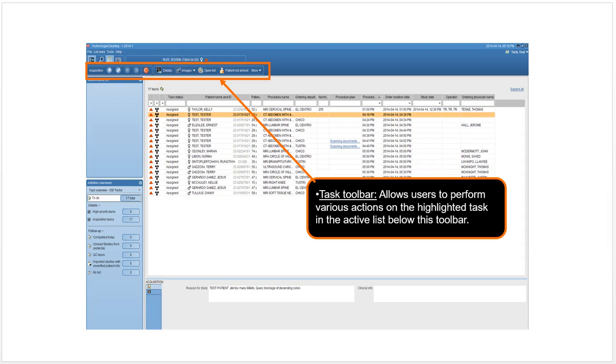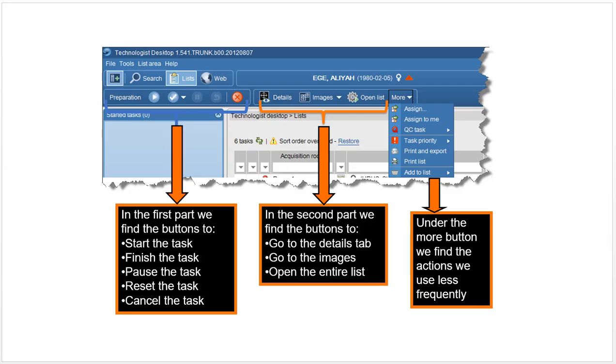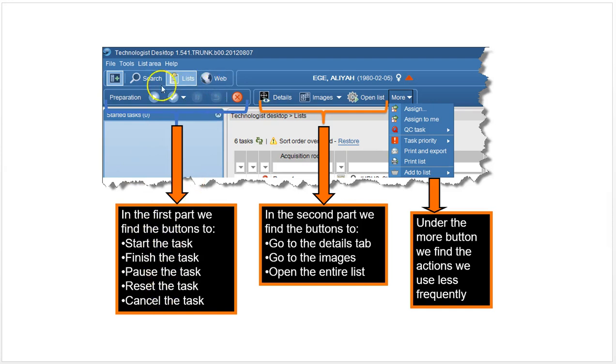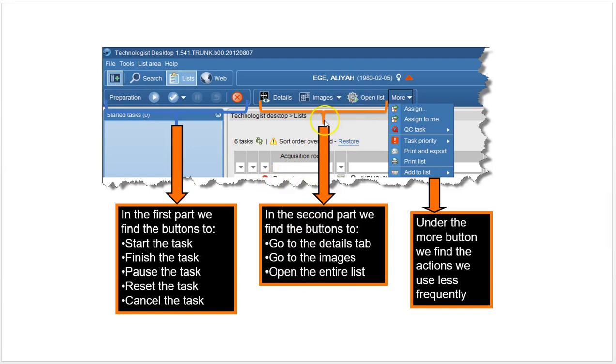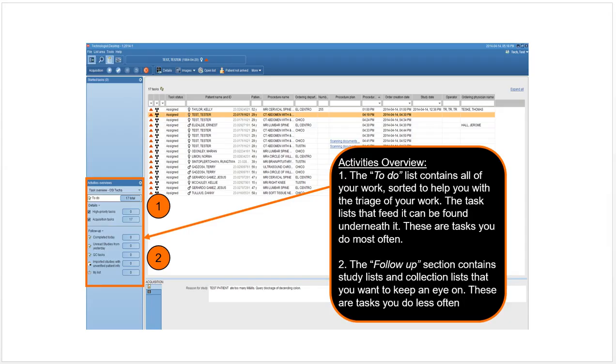In the technologist taskbar, you have start the task, finish task, pause task, reset the task, cancel the task. Here you have go to details tab, go to the images, open the entire list section here. Then under more, you have a bunch of things that are used a lot less frequently, so they're all under that drop-down menu.